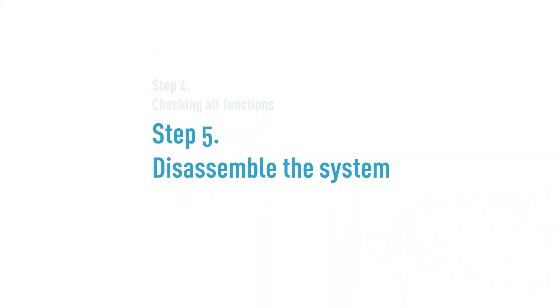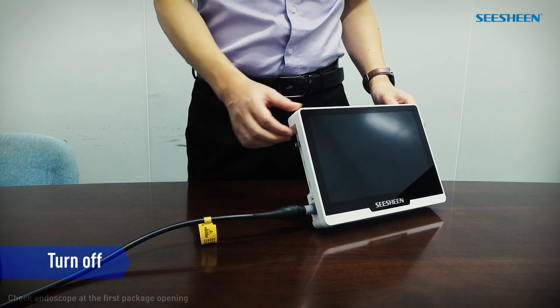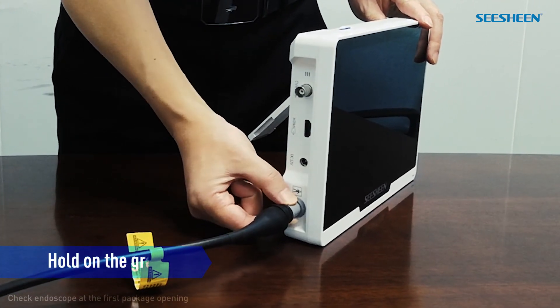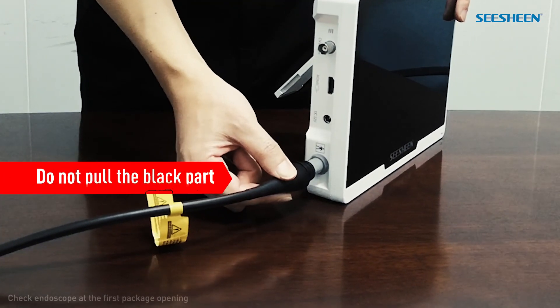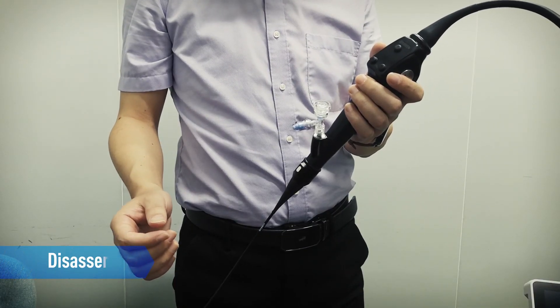Step 5: Disassemble the system. Turn off the system, then disconnect the endoscope and the image processor. Hold on the grey part like this. Do not hold and pull this part. Only hold on the grey part. Then disassemble this adapter.